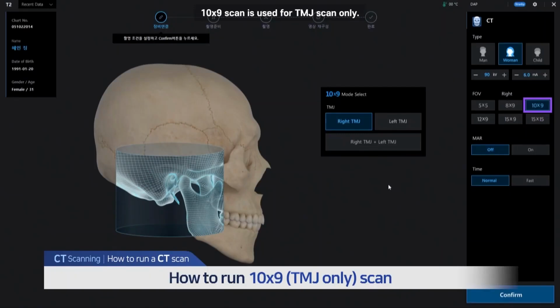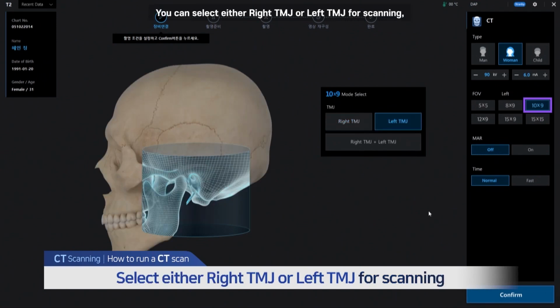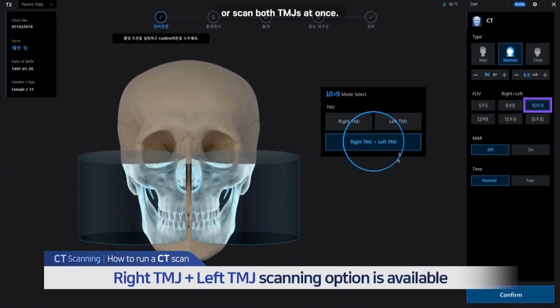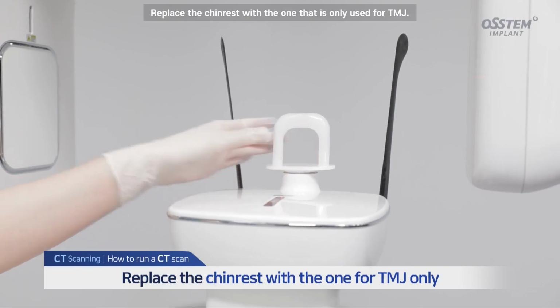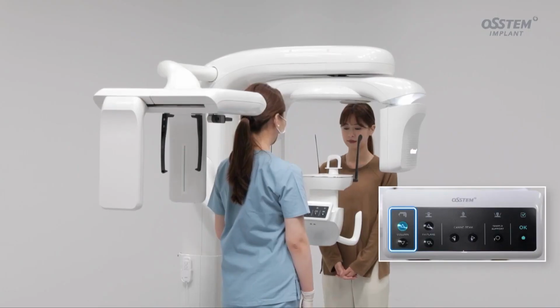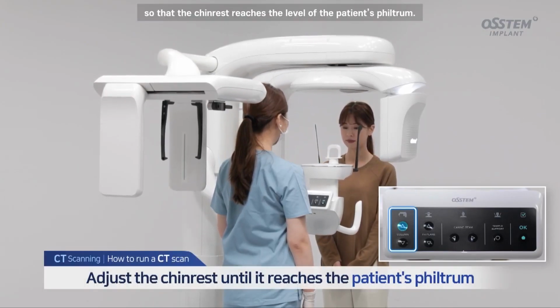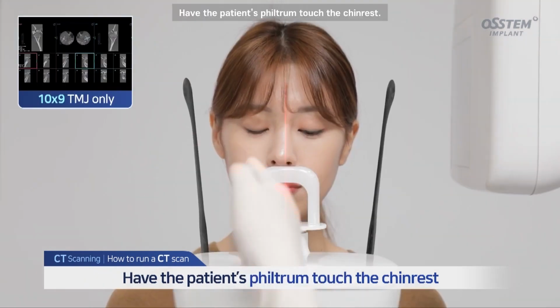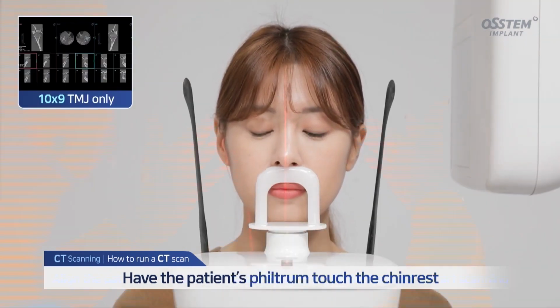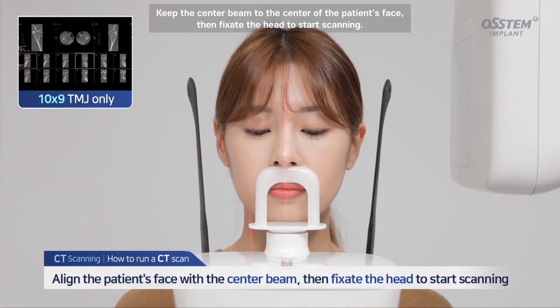10x9 scan is used for TMJ scan only. You can select either right TMJ or left TMJ for scanning, or scan both TMJs at once. Replace the chin rest with the one that is only used for TMJ. Adjust the height with the column up-down button, so that the chin rest reaches the level of the patient's philtrum. Have the patient's philtrum touch the chin rest. Keep the center beam to the center of the patient's face, then fixate the head to start scanning.